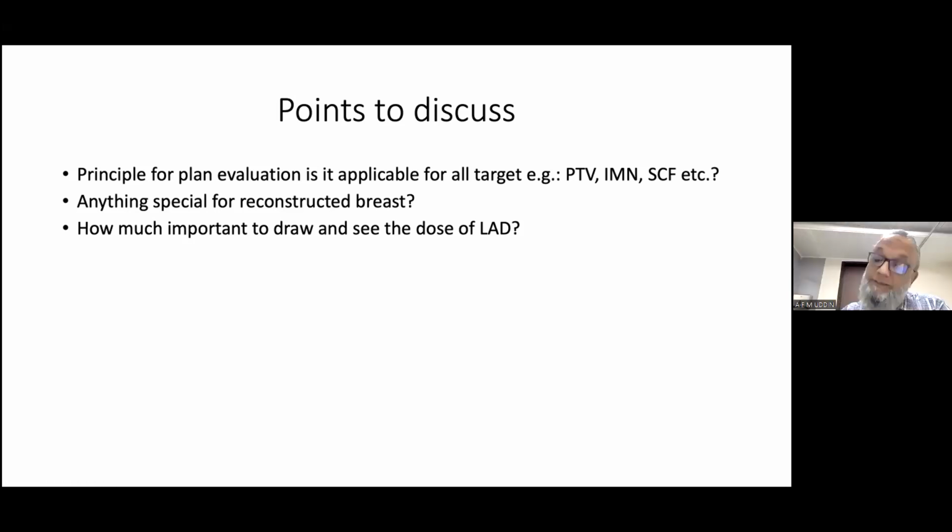So your message is you are doing D mean, but in selected patients, when you think that you need to look into it, you can go for LAD. It is good to see LAD, but till now it is not a mandatory recommendation.